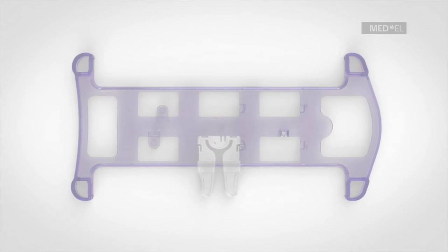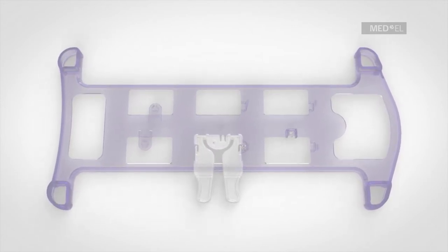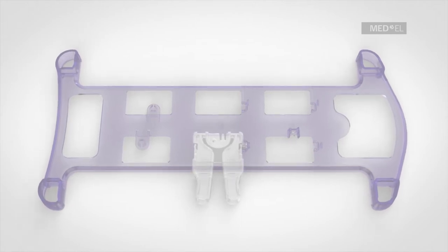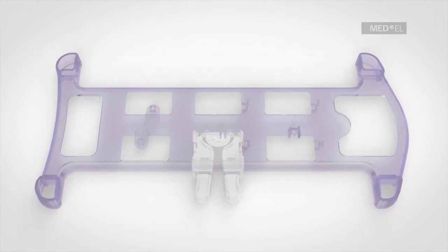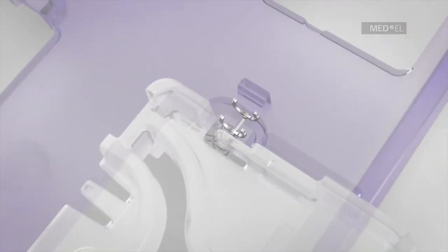The coupler is delivered with a specially designed holding frame that helps to position the FMT correctly and easily. With this coupler, the orientation of the conductor link is very important.